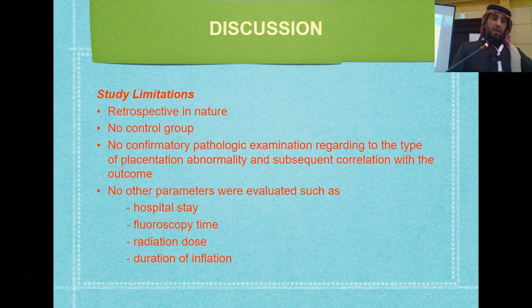Our limitations: our study is retrospective, and there is no control group. At that time, we did not measure the radiation dose, which I think is a criticism of our study. Hospital stay and fluoroscopic time weren't recorded at that time, and the duration of balloon inflation was not recorded.